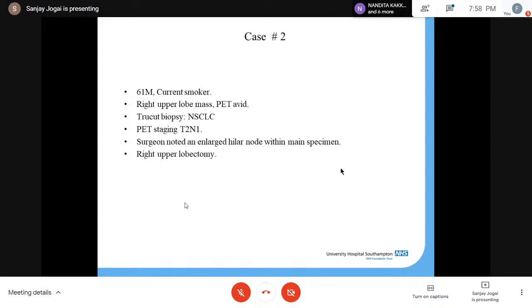Rajiv. We also feel, I think by the time the next WHO classification is published, this will be incorporated. One of the reasons why it is not, in my opinion, is that morphologically sometimes you see a case where the features are so typical of a low-grade neuroendocrine tumor, whether it is typical or atypical carcinoid, but the proliferation is high.